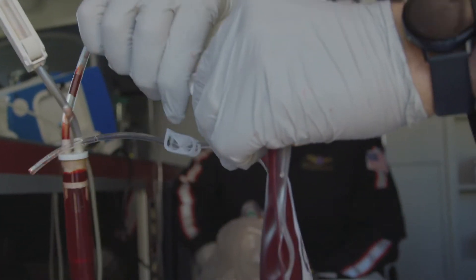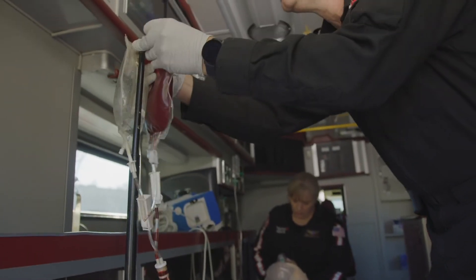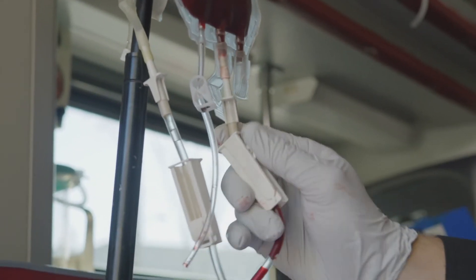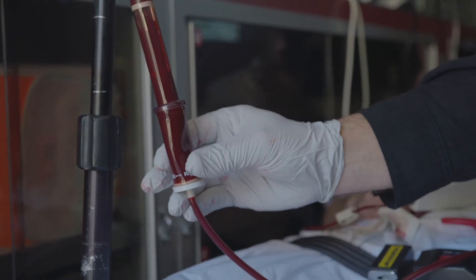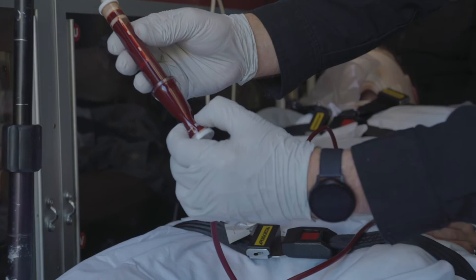If the air check is engaged, stop infusing. Close the clamp and spike another bag of blood or fluids. Open the desired clamp and reprime to remove air from both chambers. Reset the air check by squeezing below the ball.